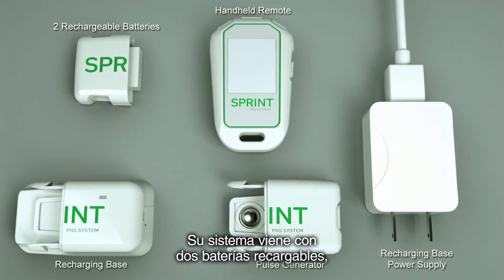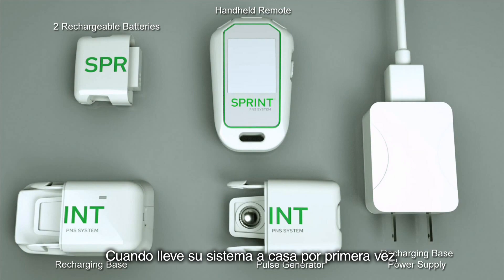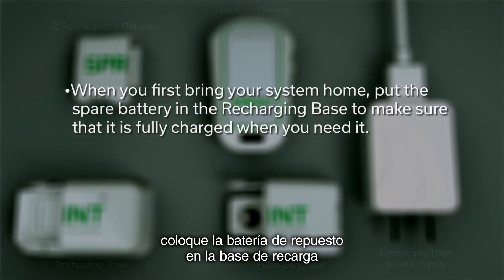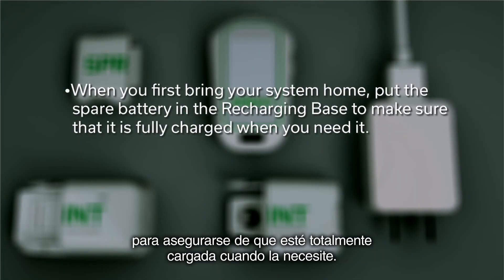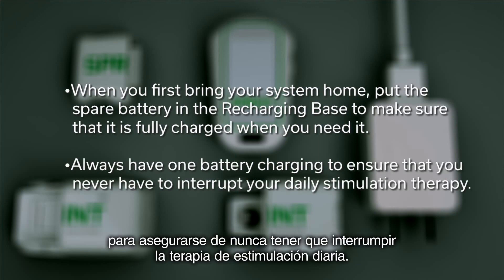Your system comes with two rechargeable batteries, a recharging base, and a recharging power supply cord. When you first bring your system home, put the spare battery in the recharging base to make sure that it is fully charged when you need it. Always have one battery charging to ensure that you never have to interrupt your daily stimulation therapy.